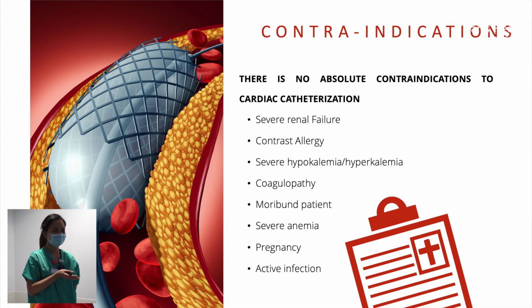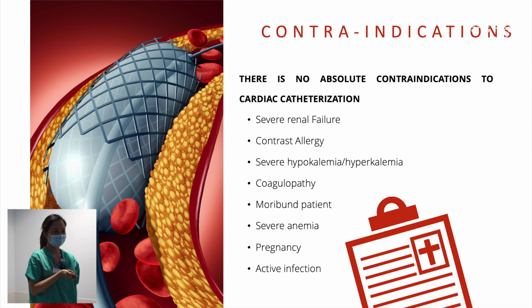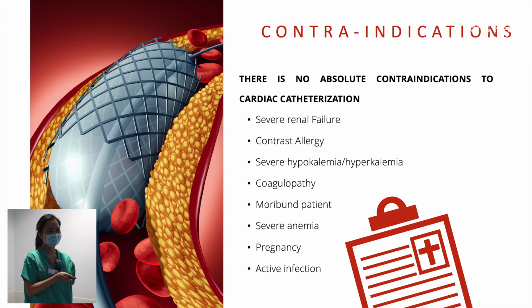If the patient comes for an emergency, there's still an MDT that should be done prior to bringing the patient in the lab. Next is active infection. We don't normally bring patients who have active infections in the lab. It's either they already have antibiotics going on, or we treat them altogether before having the procedure.